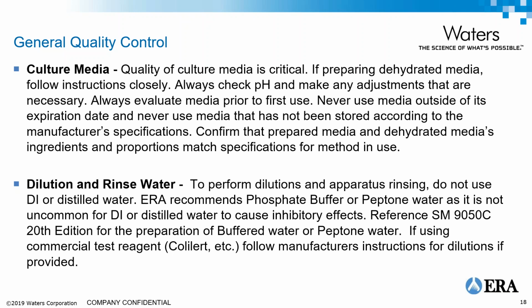Also, if you're doing any kind of dilutions, like with a Colilert product, and the manufacturer has recommendations for what's used for their product dilutions, follow their instructions.